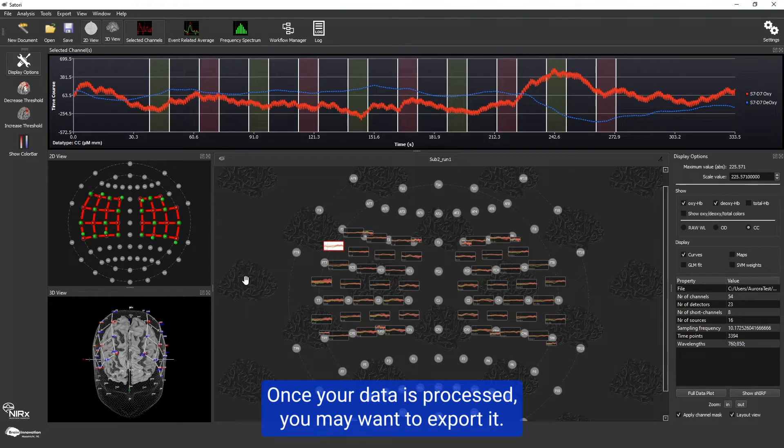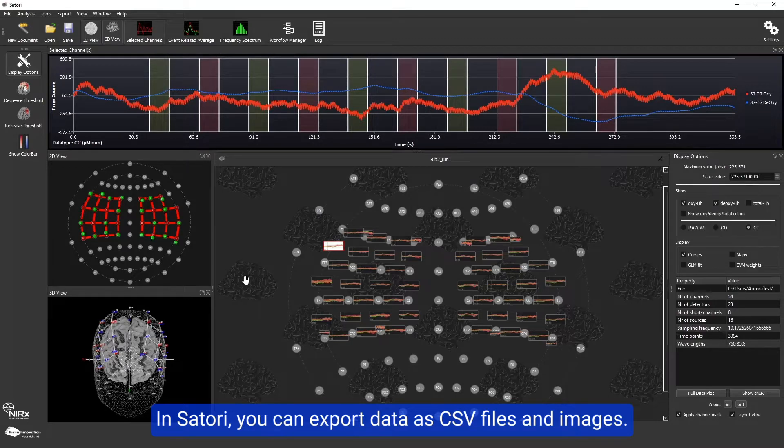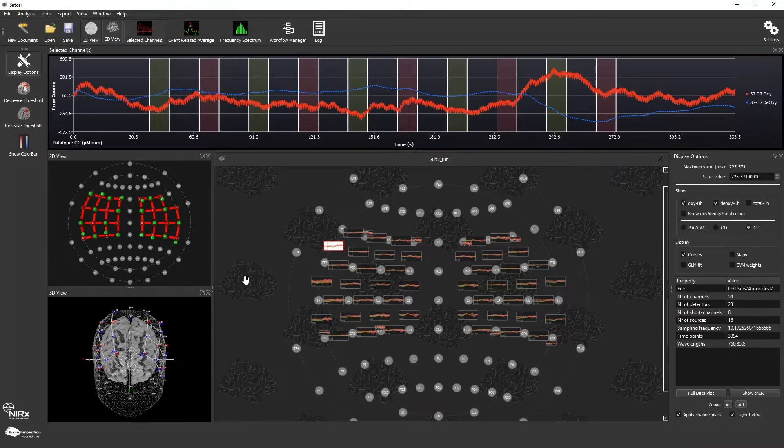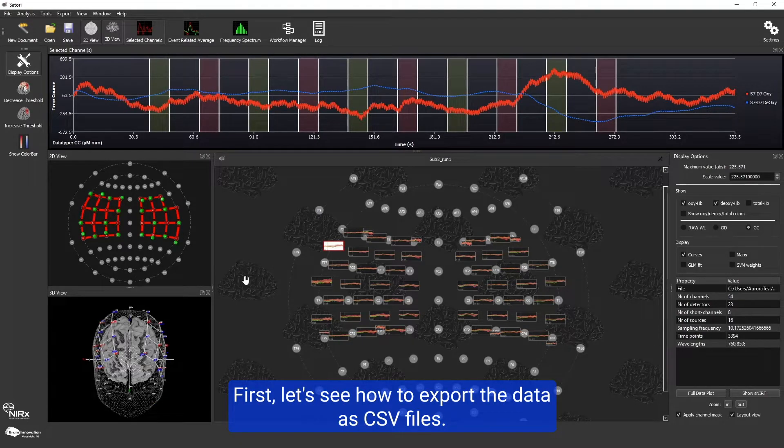Once your data is processed, you may want to export it. In Satori, you can export data as CSV files and images. First, let's see how to export the data as CSV files.